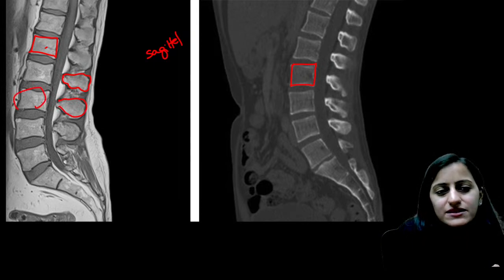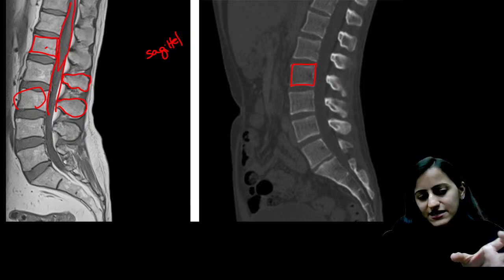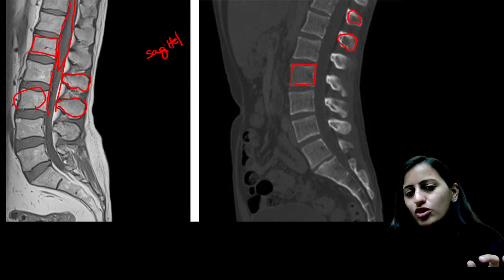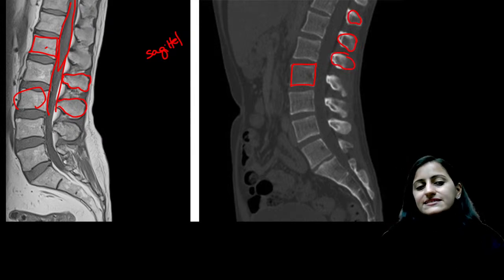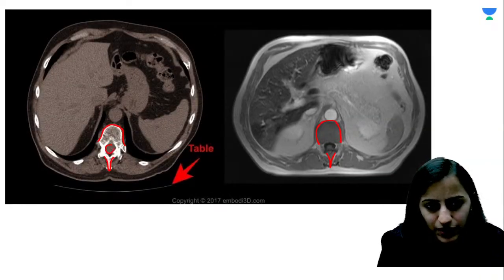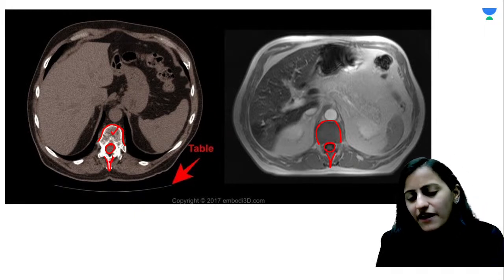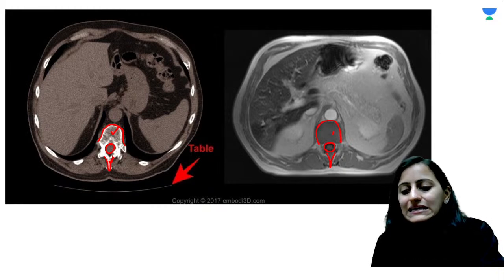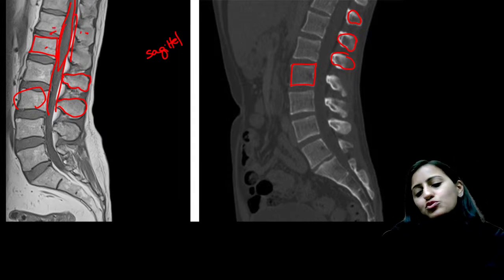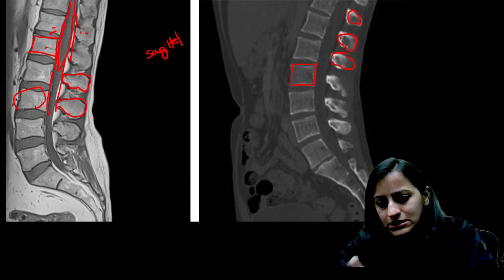Okay. In between the two is where you have the vertebral canal, right? आपका spinal cord जाएगा जहाँ से. This is the posterior element, the spinous process. The bone cortex is white. This is a CT scan, right? So here, like you see in the axial section, this is where you will have the spinal cord between the body and the spinous process, right? So this is where you have the spinal cord, दोनों के बीच में. Nuzhat, is that clear? Any other query here?